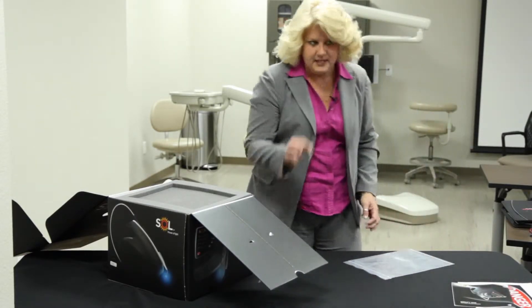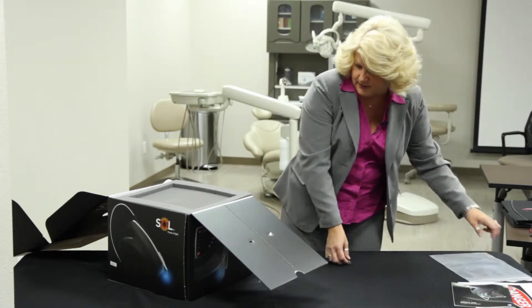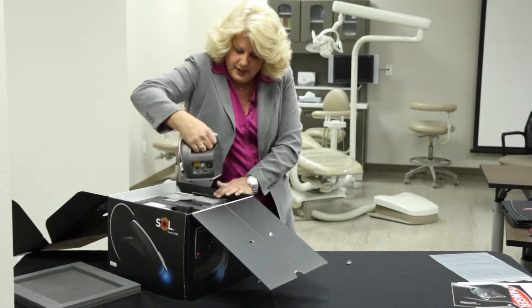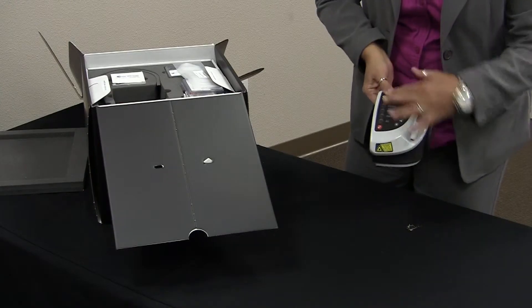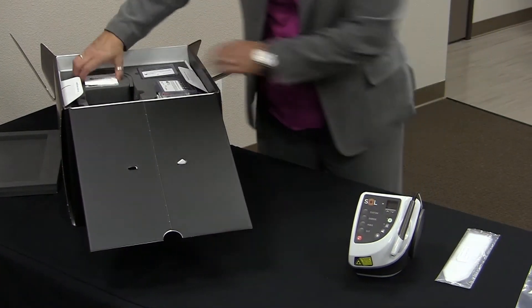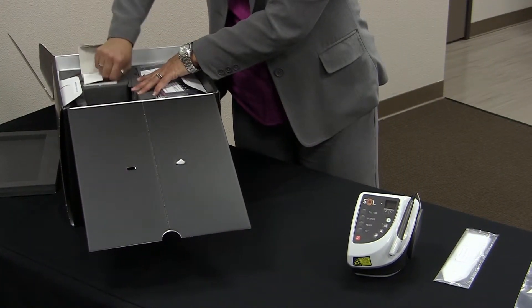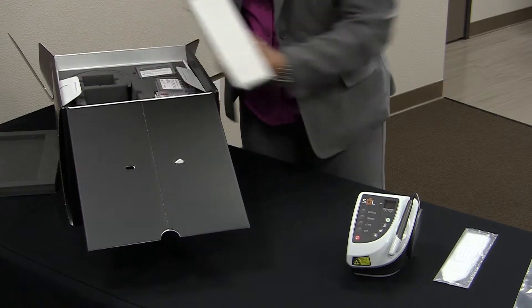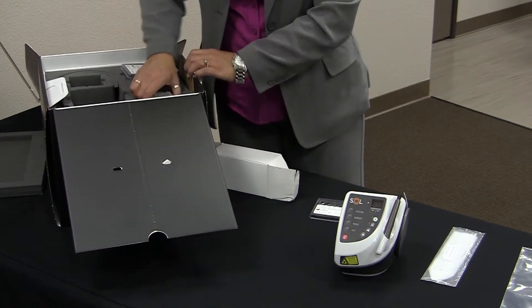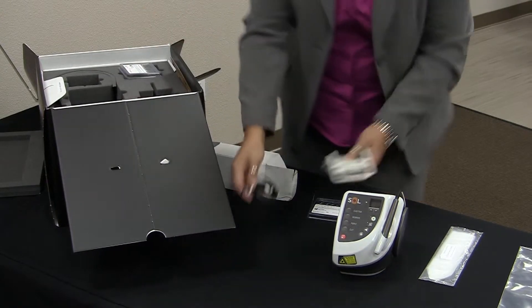You're also going to find a set of keys, which are very important, so we're going to set those aside just for a second. And we're going to start to unpack your laser. Here is the unit itself. We also have some sheaths that go over the handpiece, the AC adapter, a set of tips, and also your foot pedal.